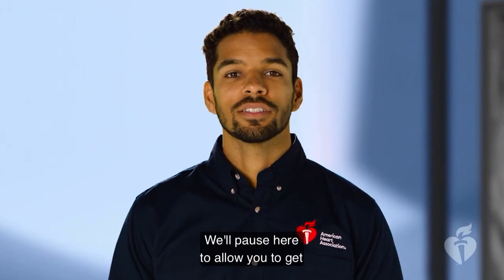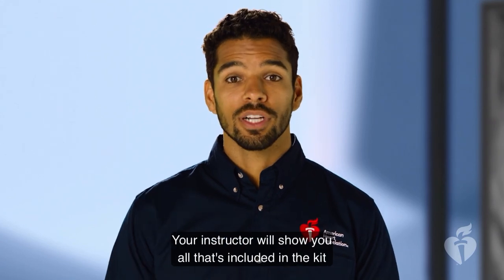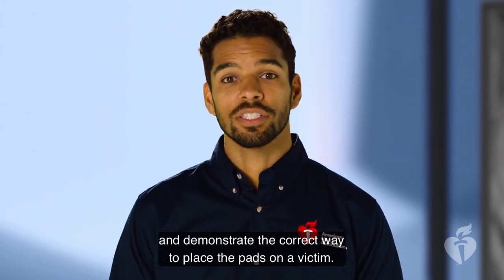We'll pause here to allow you to get familiar with the AED in your class today. Your instructor will show you all that's included in the kit and demonstrate the correct way to place the pads on a victim.